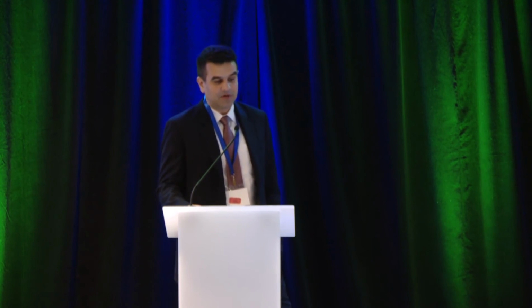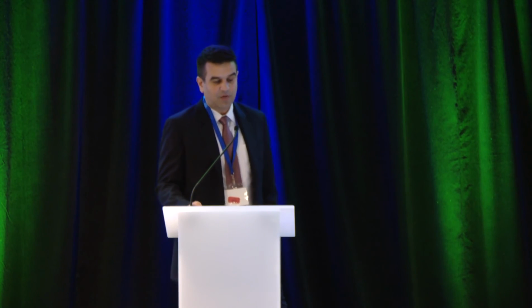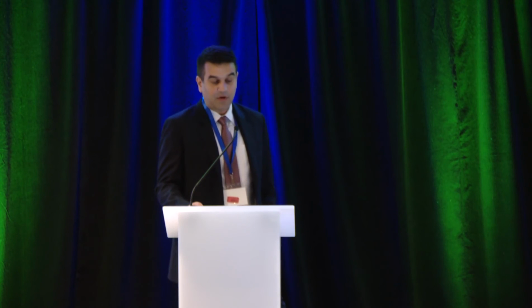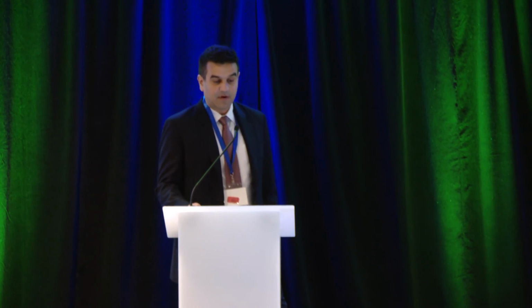Now, it's also recommended you describe this outflow obstruction in the context of peristalsis. You can see the image down there on the bottom right, whether or not there are hypercontractile features, spastic features, ineffective motility, or no evidence of disordered peristalsis. Now, the authors of the subgroup on EGJ outflow obstruction also came out with this clinical algorithm in their technical review, which really simplifies this entire process, where you go down this algorithm and you may end up, if you do have an abnormal esophagram and/or FLIP or pharmacologic provocation, with this conclusive diagnosis. But if you don't end up all the way down there, you have an inconclusive diagnosis of outflow obstruction, and they even recommend saying, refrain from definitive therapy and consider repeat testing.